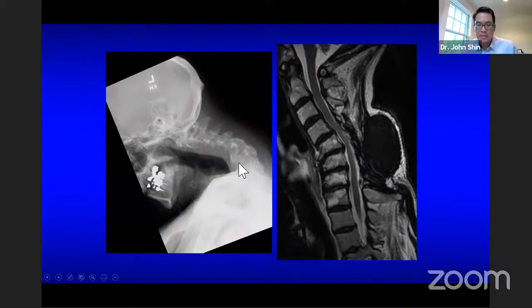You can see the collapse that's there. And just look at the supine MRI and look at the standing x-ray, right? So you look at the supine MRI and you may think, oh, okay, what's the big deal? It looks okay. I mean, it's not great, but it looks okay. Then you look at the standing x-ray and it's really pretty obvious.